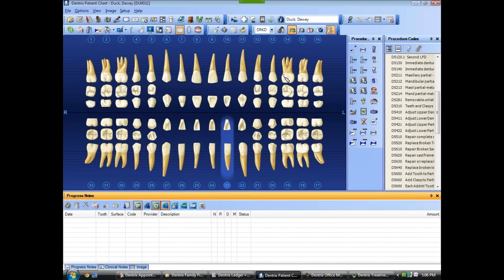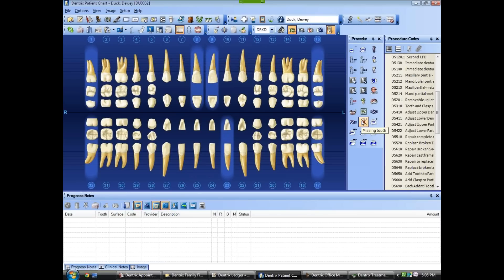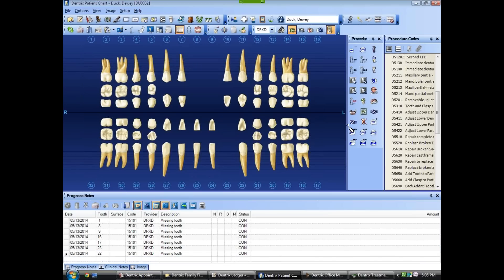The patient is missing teeth 1, 32, 17, 16, 8, and 9. Now let's put in some existing conditions.